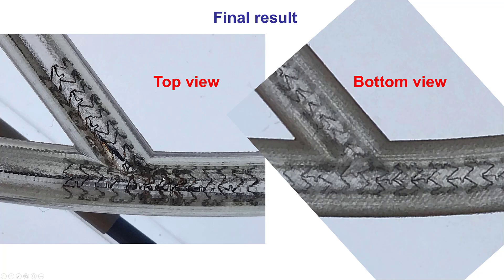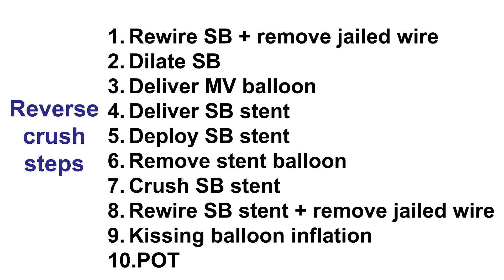Here you can see the stent — it's more on the top of the vessel in this view, whereas on the bottom there is no crushed stent, so the crushed stent struts were on this portion of the vessel. The difference and disadvantage of this technique compared with the regular DK crush technique is that the crushed stent is inside the main vessel stent, whereas in the DK crush technique, the crushed part of the side branch stent is on the outside of the main vessel stent. These are the 10 steps for performing the reverse crush, which can be a bailout technique when provisional stenting results in significant side branch compromise.